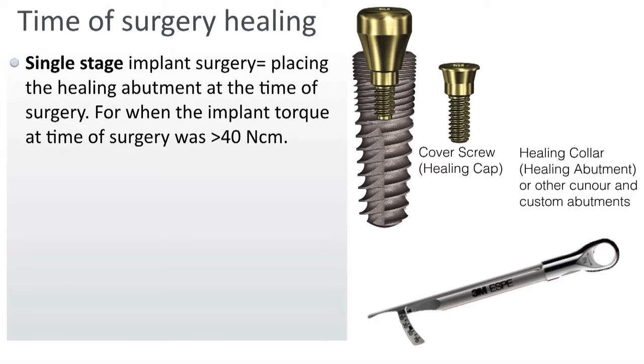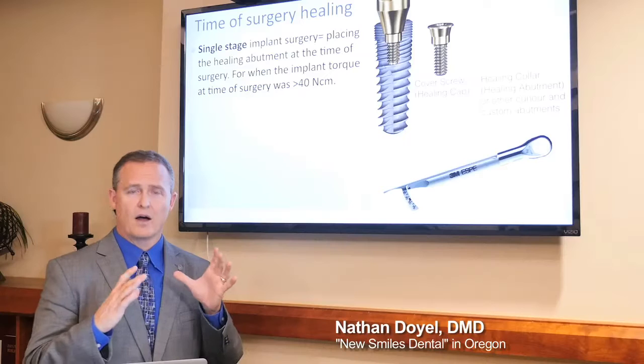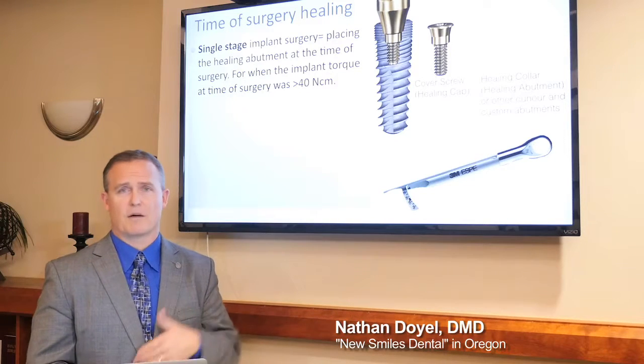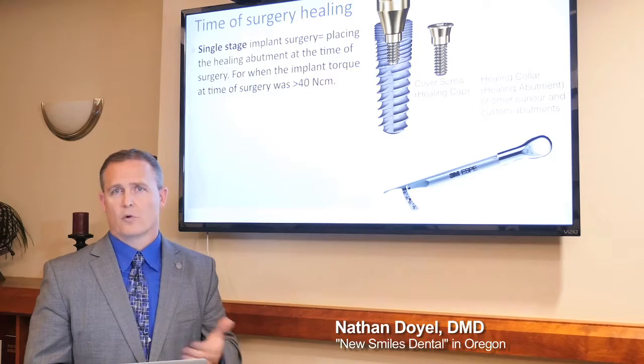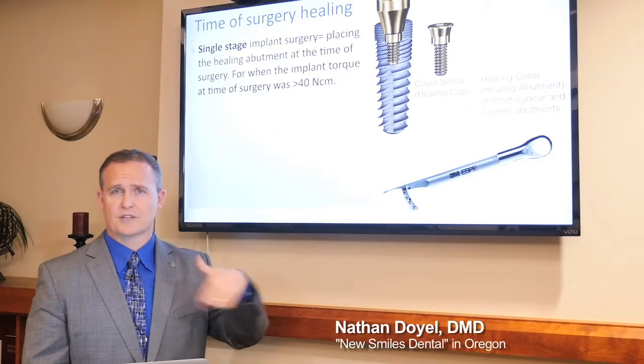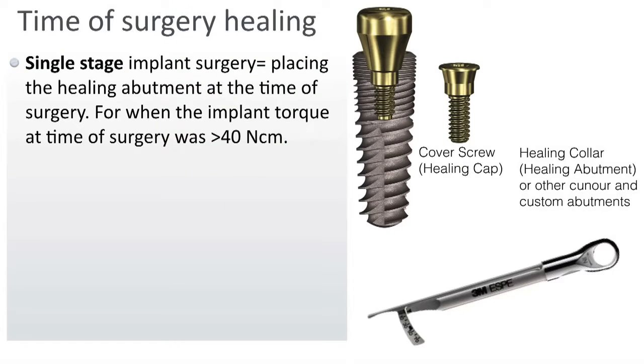That's typically, in my case, when I have an implant torque better than 40 Newton centimeters. When I have that, I've got good stability. And if I have good patient compliance, I might choose to put the healing abutment on at that time and suture everything around it. That way in 4 to 6 months, when they come back, the healing abutment's already on there. I don't need to do a second stage. So that's called a one stage.